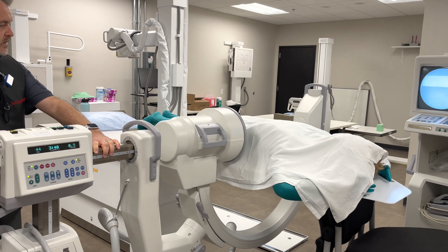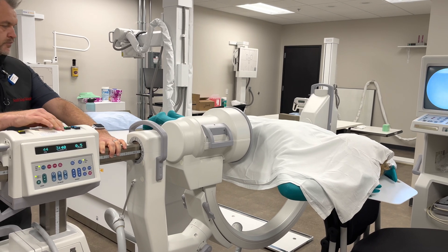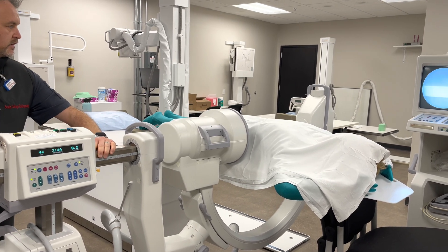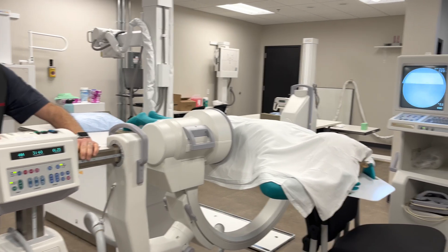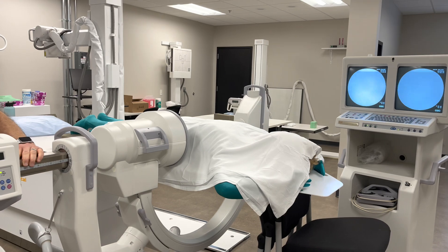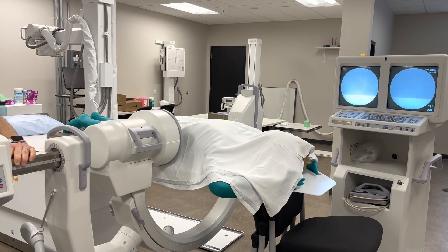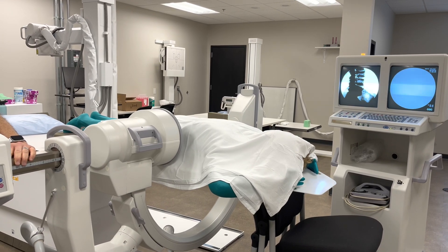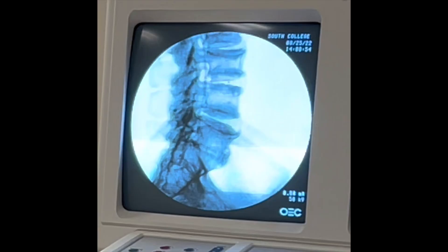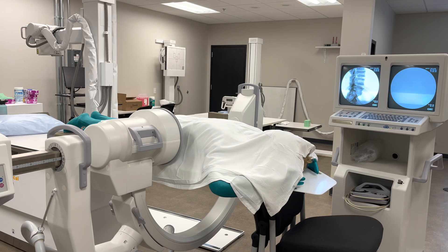Get yourself in position and then take that image x-ray. So we have S1, L5, L4, L3, and a portion of L2, so you can confidently count from there.